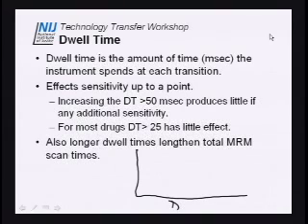What I have found, and I mean the GBI crime lab, including Lisa, it's sort of a royal I. If you look at dwell time here, and intensity here, so this is the total ion counts, what you're going to see, if this is 1, 2, 3, 5, 10, is it's going to kind of go like that. And this is for most drugs, not all drugs. As you increase the dwell time, you're going to get some sensitivity increase, and it's going to kind of flatten out. Where it flattens out depends on the drug.